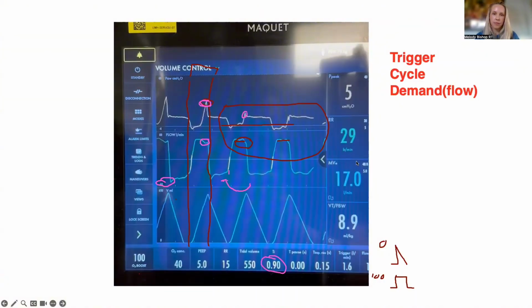Even if you have a big tube, an 8.5, the only time we put in an 8.5 is in the bronch suite when we're doing EBUS. In the ICU, very rarely. In patients who have obstructive disease, you should have a bigger tube, maybe not 8.5 because then you trade off and get subglottic stenosis and all that. But even an 8 is still smaller than the trachea.